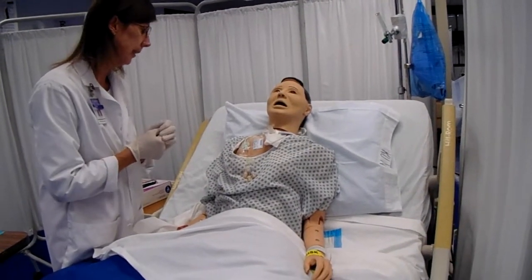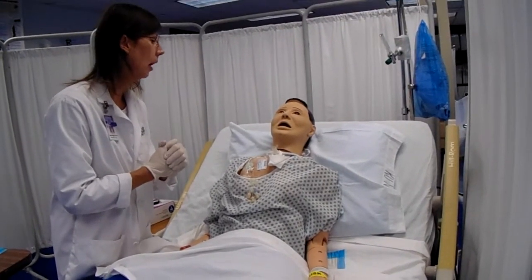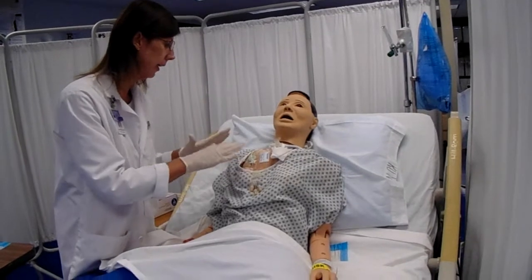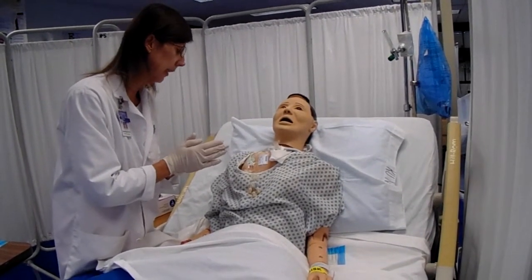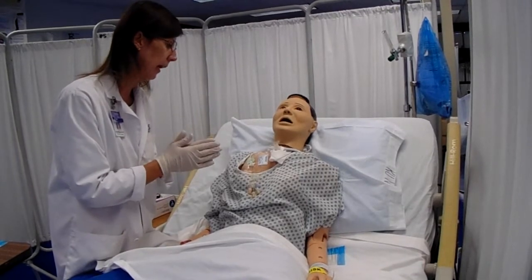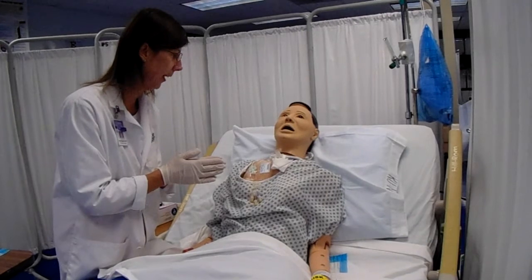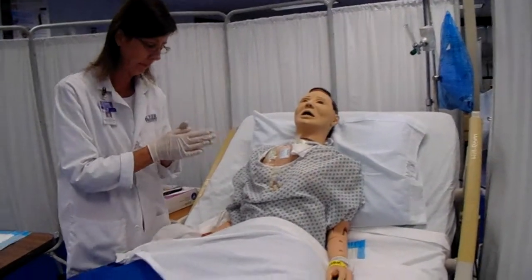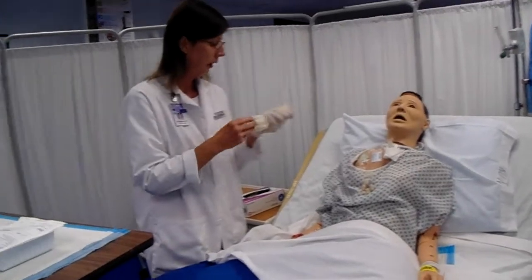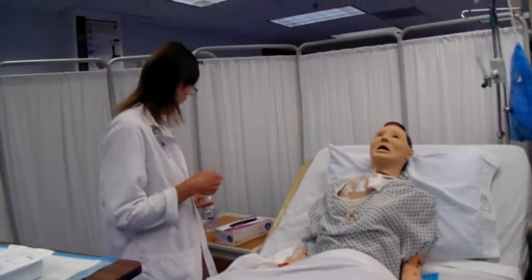Alrighty, so what I'm going to do is gather my supplies for a dressing change. It shouldn't be uncomfortable. There'll just be a little tugging on your skin area where the sticky stuff is. It should last about 5 or 10 minutes, and let me know if you feel any uncomfortableness. Okay? Thank you. Patient verbalized understanding. I will now remove these gloves, perform hand hygiene.